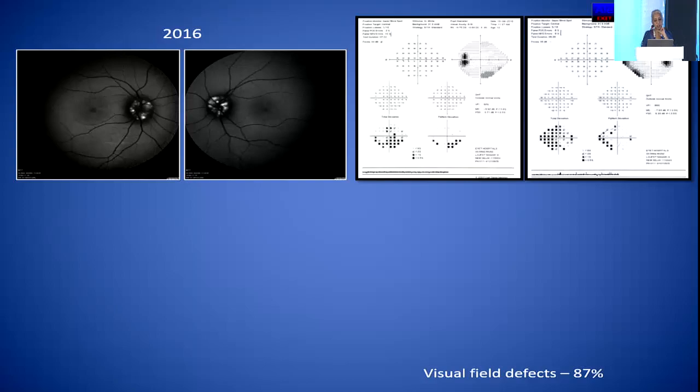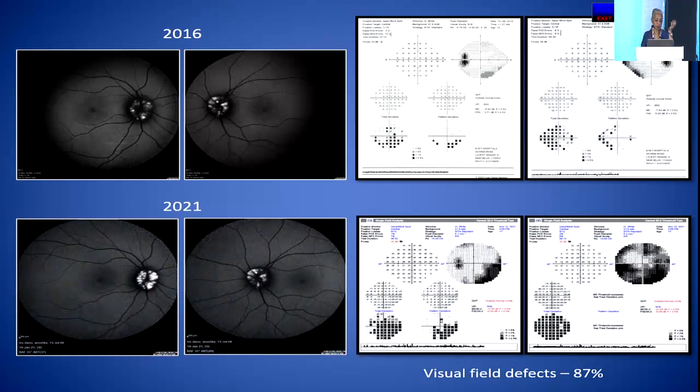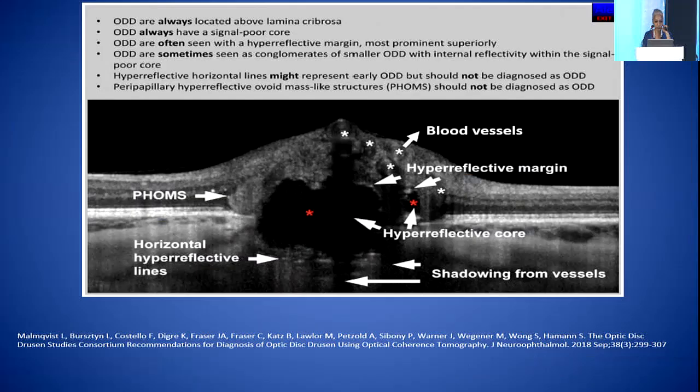The second most common condition which we encounter in the OPD is optic disc drusen. Now we know that drusen is not merely an incidental finding or a benign pathology, and frequently with the years it becomes more superficial, with RNFL thinning, ganglion cell loss, and progressive visual field loss as well. So we do want to detect drusen as early as possible for prognostication.